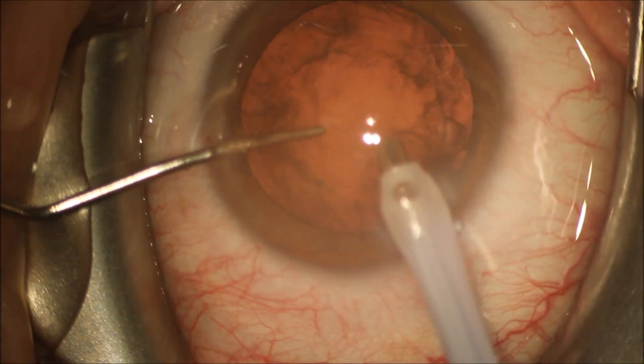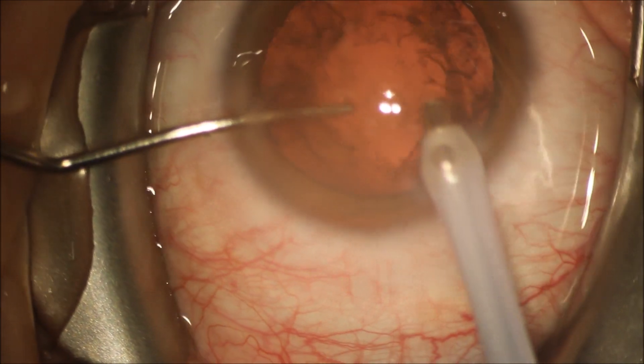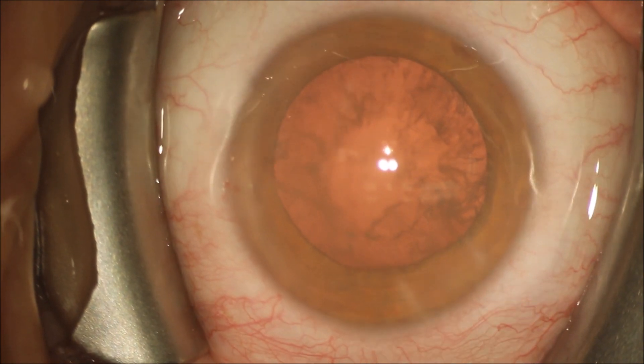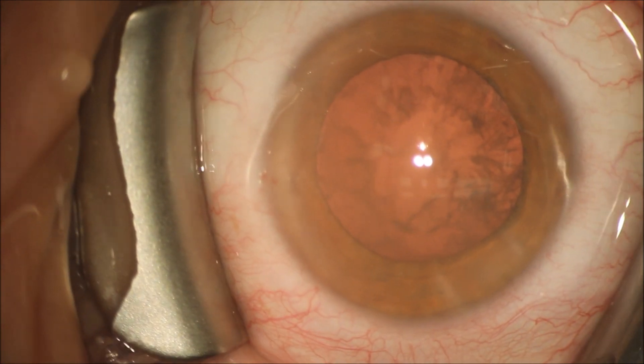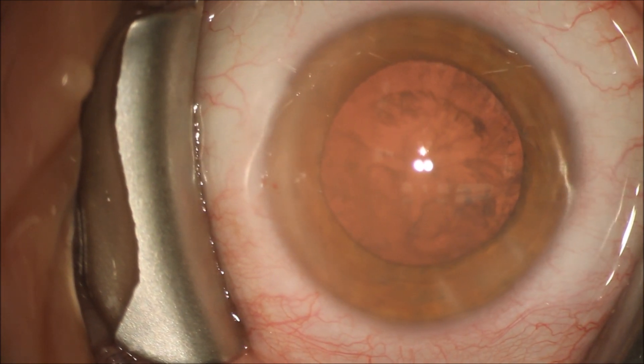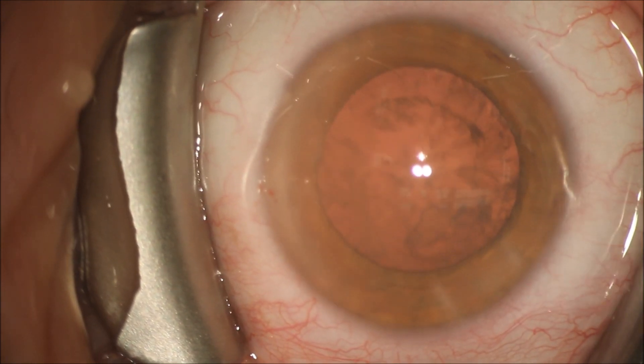You can see the cataract was very easily evacuated out of the eye in less than probably 30 seconds, and we're left with the cortex — the material that is more firmly adherent to the capsular bag where the cataract used to sit.